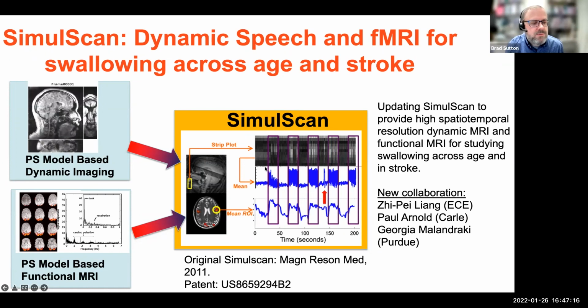And we were really surprised when we did this the first time that we saw a little blip here, and we saw brain activation going with it. And we went back to look at the movie, and we saw the subject swallowed. And so we picked up an incidental swallow and the brain activity associated with it. And so this goes back to that resting state is not task-based. We didn't give this person a task to swallow, but eventually we redid this experiment where we told people just to sit in the scanner and watch a movie. We didn't tell them what we were doing, but we were actually watching them swallow. And then we pulled out all the brain activations associated with natural swallows.